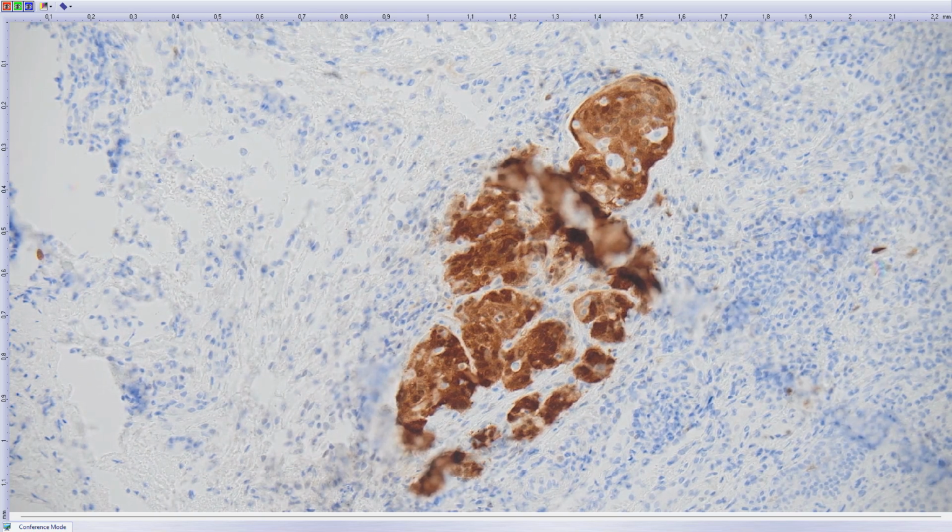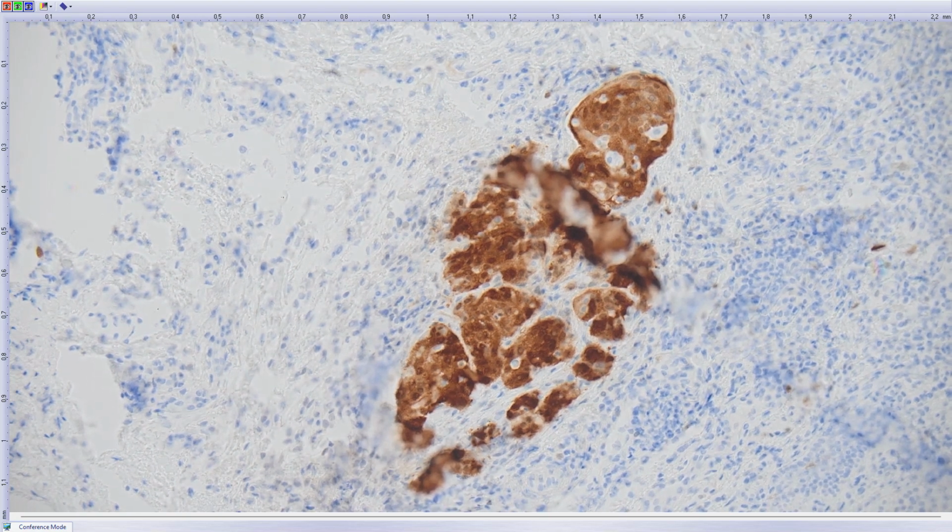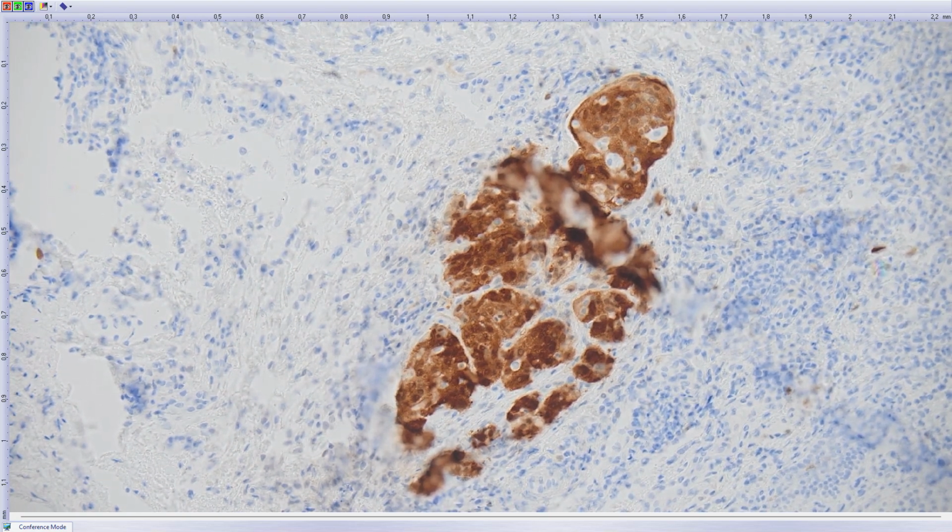And again, it's not graded, it's considered a very well differentiated tumor with very good prognosis, unless the patient has other risk factors, because smoking, for example, alters the prognosis of HPV associated oropharyngeal carcinoma. So that's it from my side.